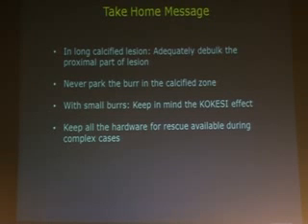Actually, if you look at it in a lighter way, it reflects from the Mahabharata epic, more like Abhimanyu, a young character who went through the toughest phase and can take rounds and rounds but really cannot come out of that particular zone. And always keep all the hardware for rescue available during a complex case, especially if you are doing rotablation, because you don't know when you will be caught unawares during a simple looking case.